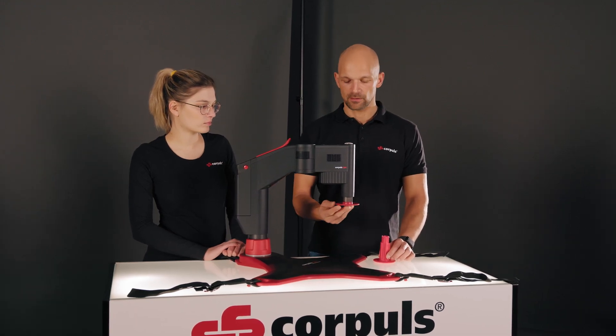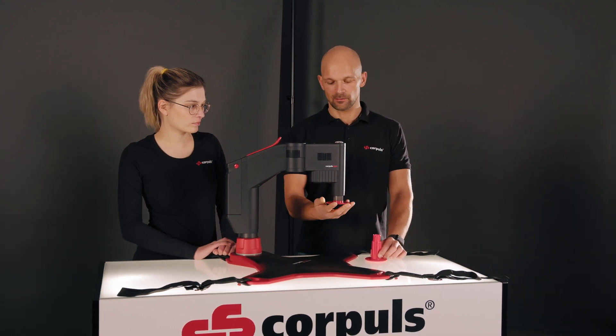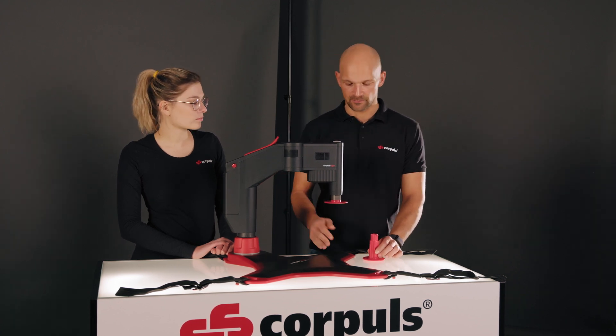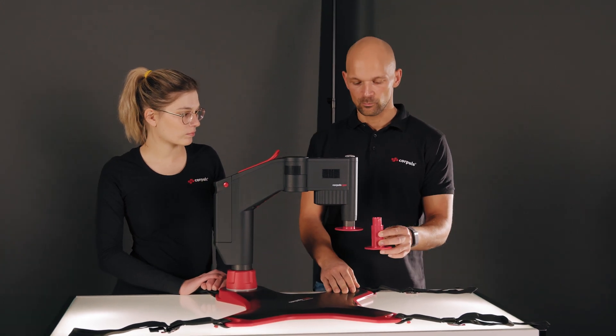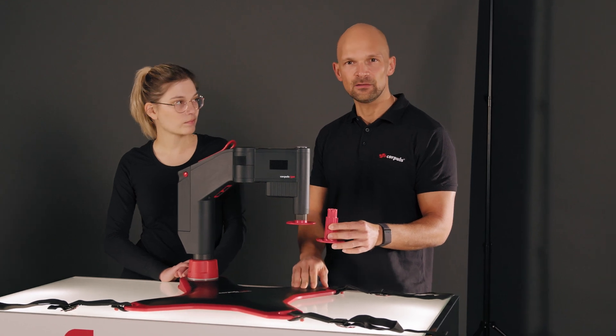To choose the right stamp length, it makes sense to already have the short stamp pre-connected to the Corpus CPR. This fits the majority of patients. The longer stamp variant is required for patients with a lower thorax height or for children. It can be easily inserted, and the transition between patients and stamp lengths is fluid.